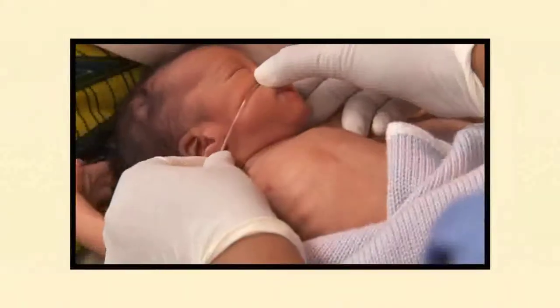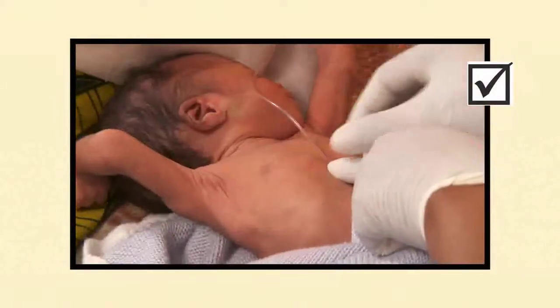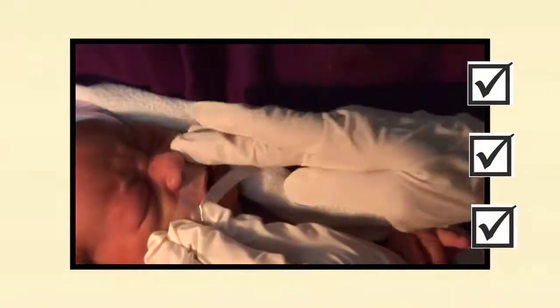Remember, measure the tube from nose to earlobe to base of the sternum. Confirm placement by listening at the stomach as you push air through the syringe, and tape the tube securely near the nose or mouth.